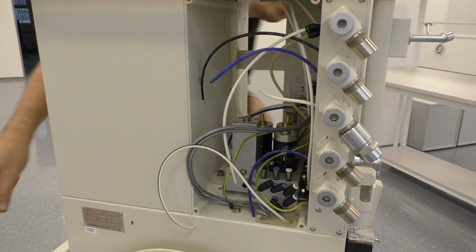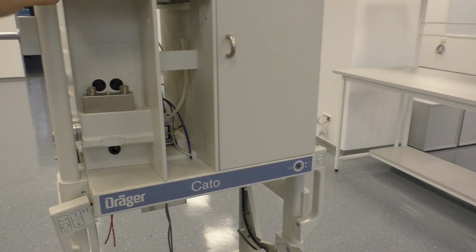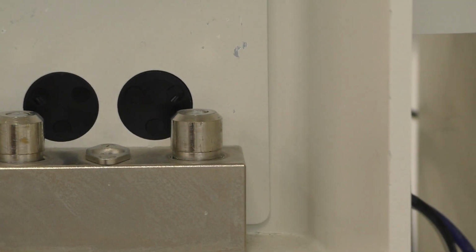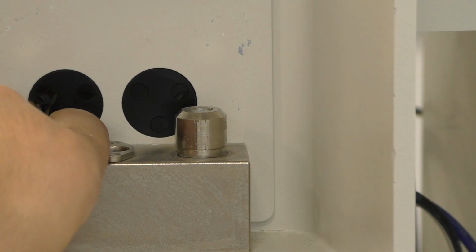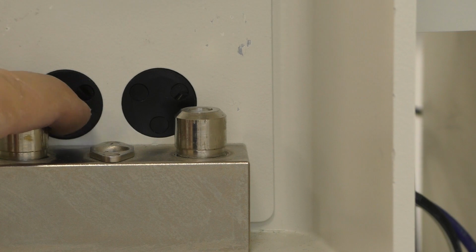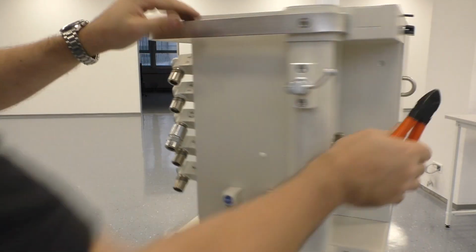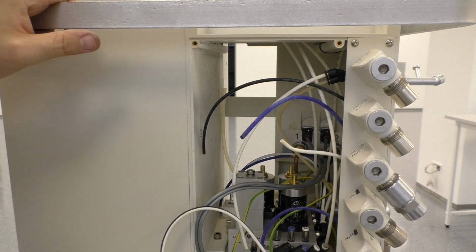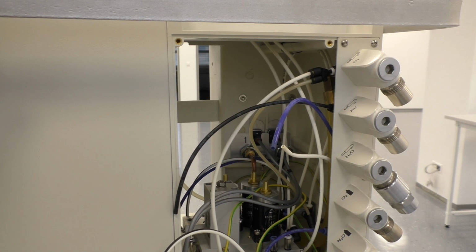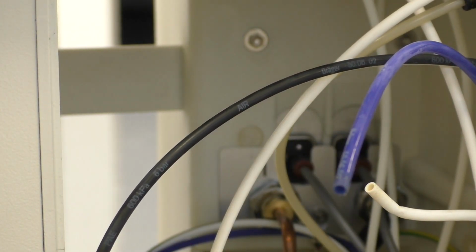Okay, what are the gray cables? Oh, some optical sensors. Let me show you that. We have here 2 optical sensors with, I don't know, a light source and 3 sensors, and something that plugs on here. And I think these sensors are made to monitor some gas ratios with a certain absorbing spectrum analyzing thing. That's one sensor here and the other one there. Maybe we should have a closer look at these things. Could be interesting if I can get them out.